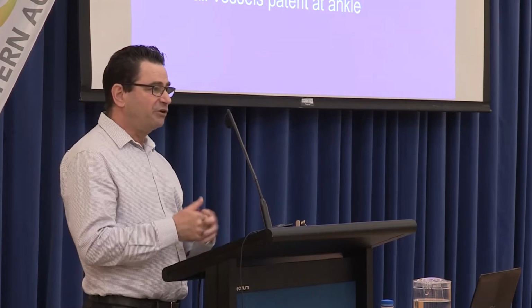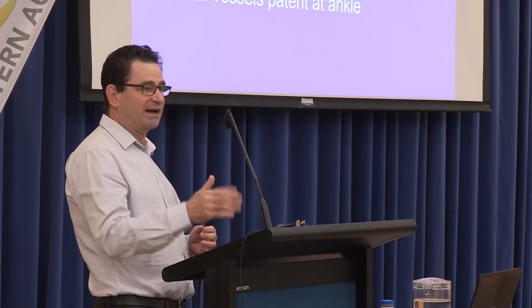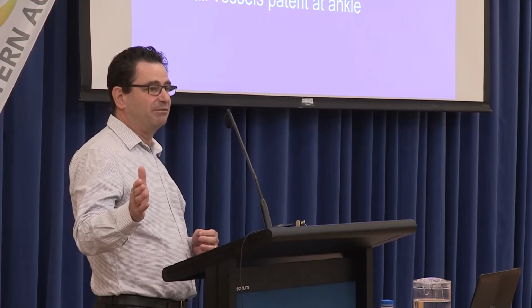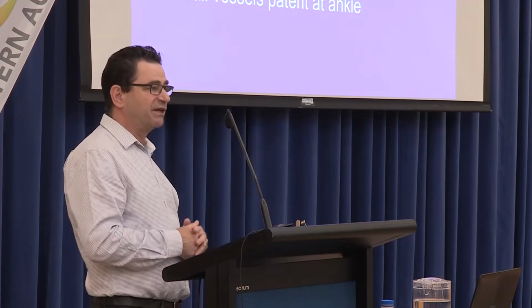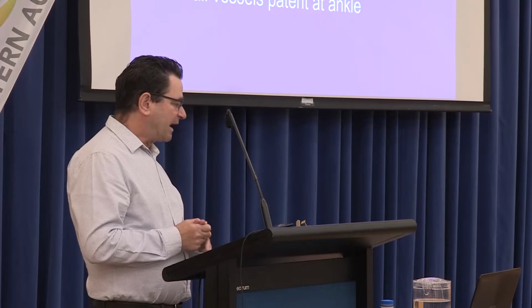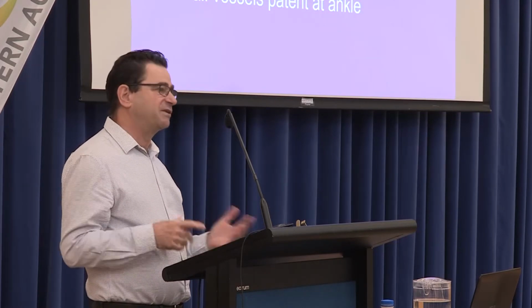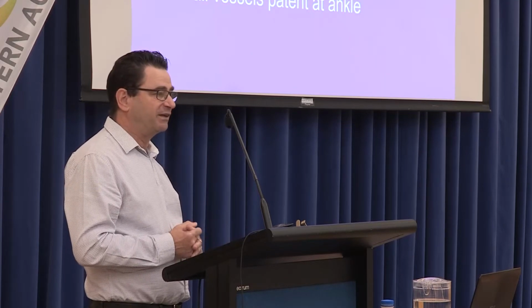So, if the blood is flowing at 50 centimetres a second in the proximal superficial femoral artery, and then we find a jet at 100 centimetres a second, there's probably a 50% stenosis there. Again, these things are only accurate to a point. And then there's occlusion. And then the other thing that you guys want to know is, are all the 3 major vessels patent at the ankle?